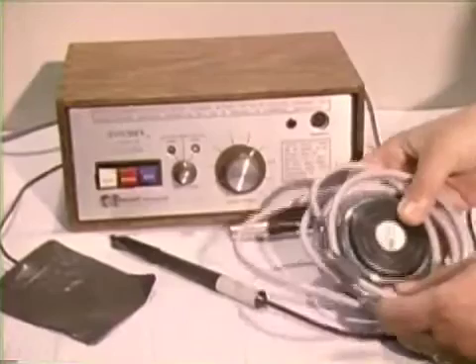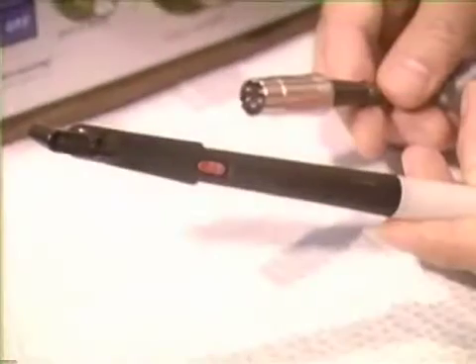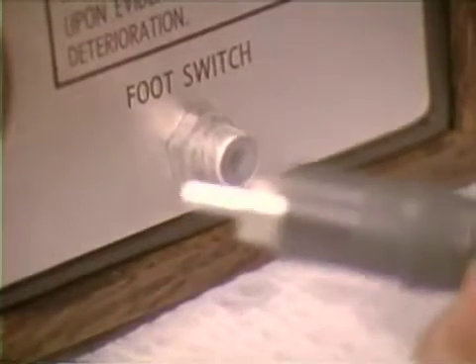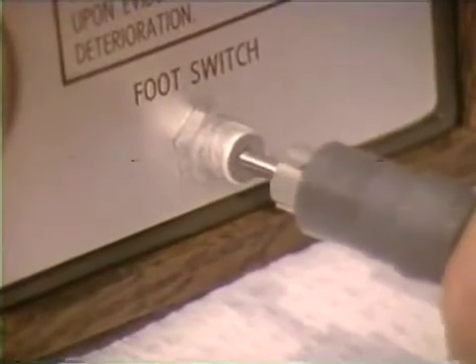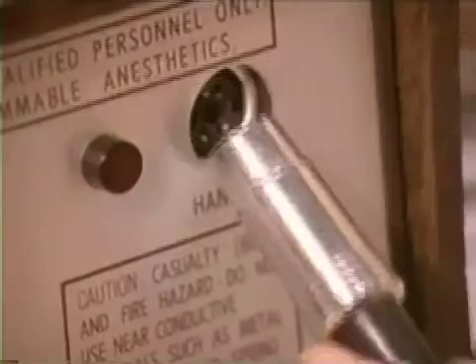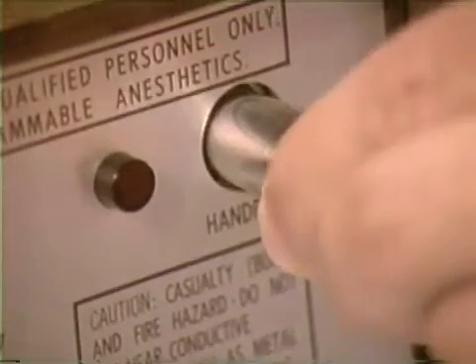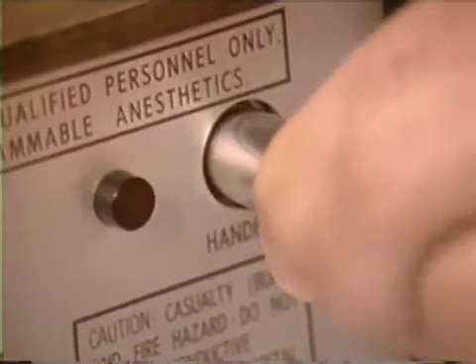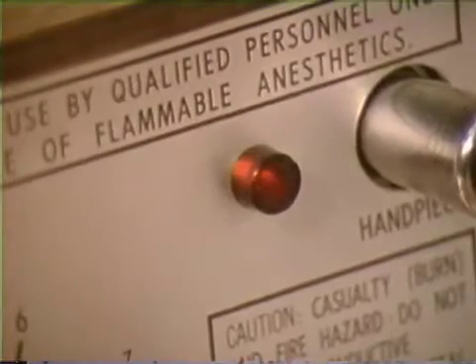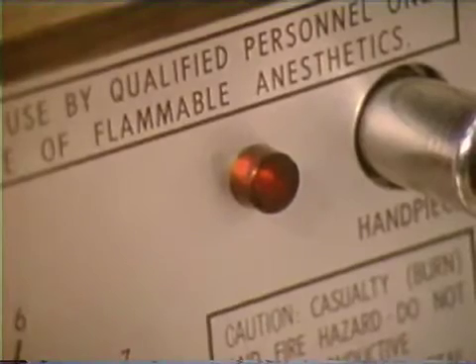The particular unit shown may be activated by a foot control or handpiece button. The foot control cord plugs into its designated outlet on the unit's front panel. Another receptacle receives the plug for the handpiece cord. Adjacent to the handpiece receptacle is the radio frequency indicator light, which glows when electrical current is being sent to the cutting tip.